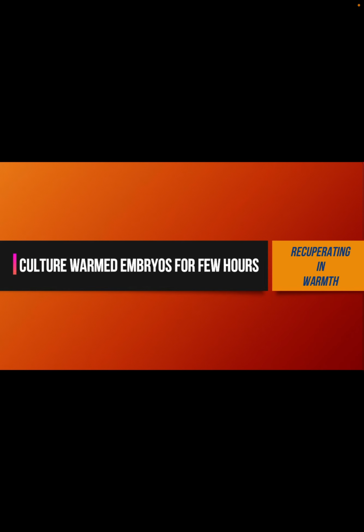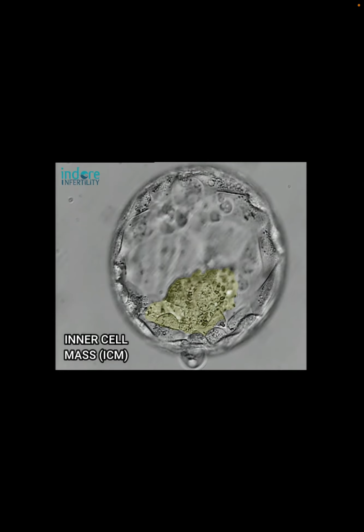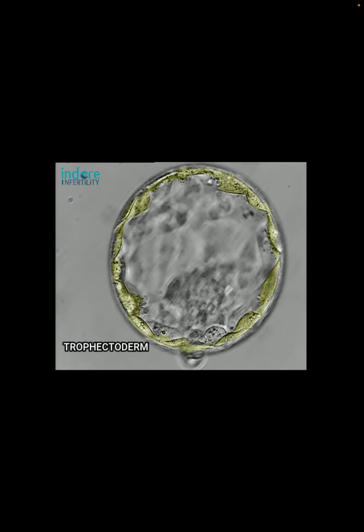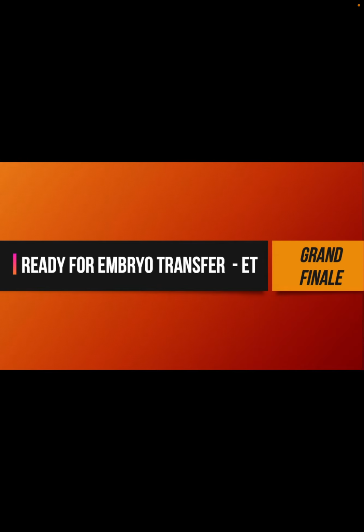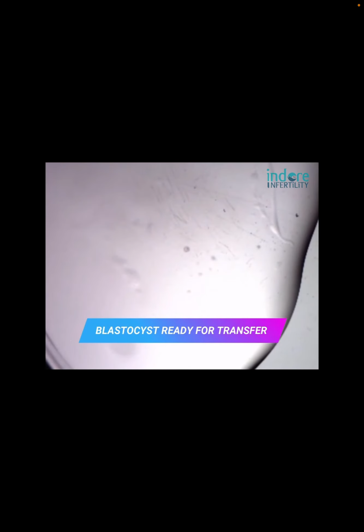Then the outer trophectoderm is being formed. Still warmed, but after a few hours, we can see the inner cell mass and outer trophectoderm. So this total embryo being formed is ready for transfer.